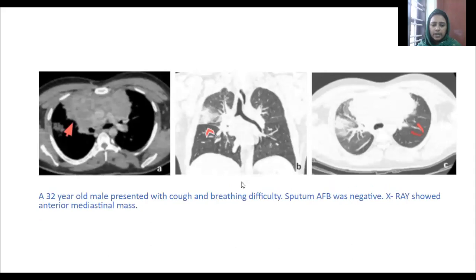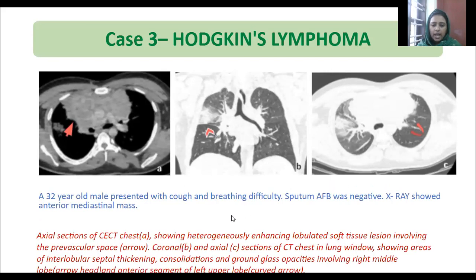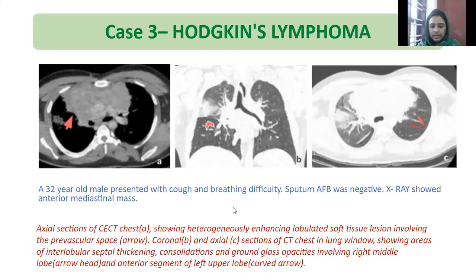Third case: a 32-year-old male presented with cough and breathing difficulty. Sputum AFB was negative and X-ray showed an anterior mediastinal mass. Axial CT chest images showing heterogeneously enhancing lobulated soft tissue lesion involving the pre-vascular space. Coronal and axial CT chest in lung window showing areas of interlobular septal thickening, consolidation, and ground glass opacities involving the right middle lobe as well as the anterior segment of the left upper lobe. Biopsy revealed Hodgkin's lymphoma.